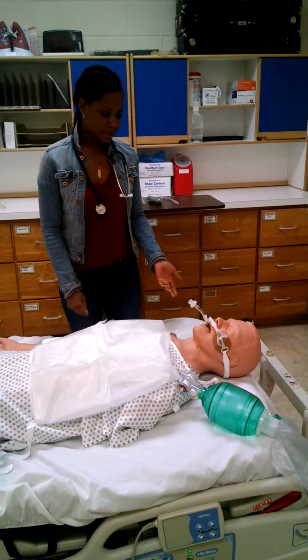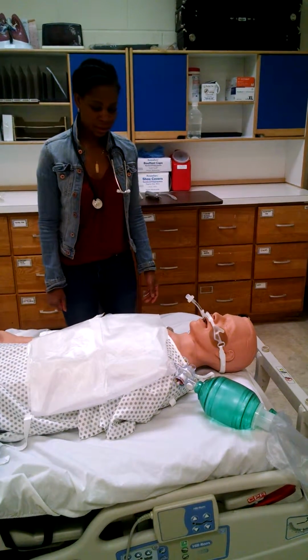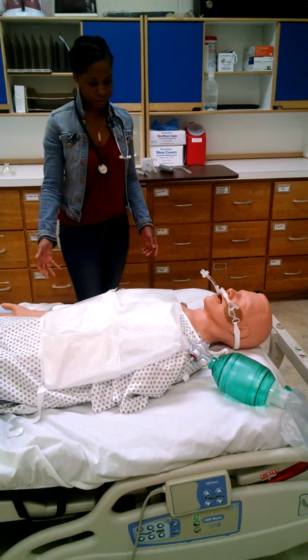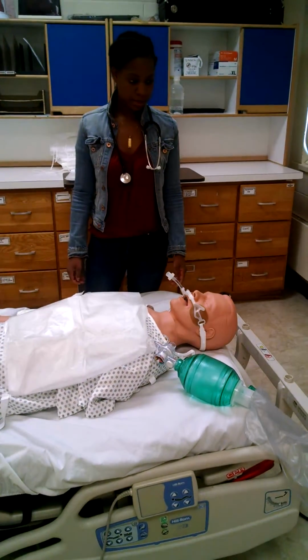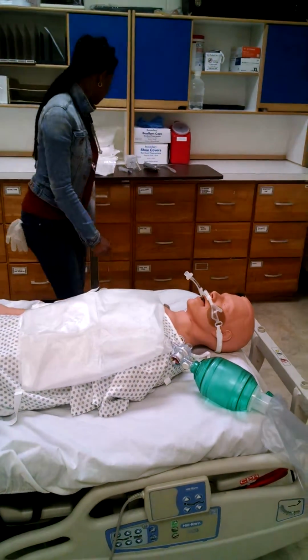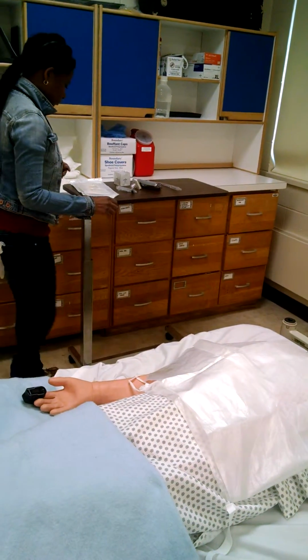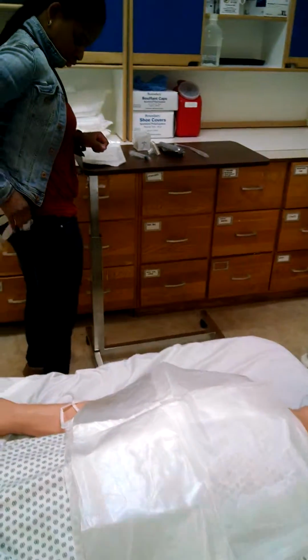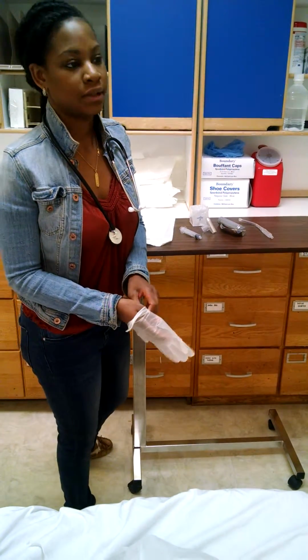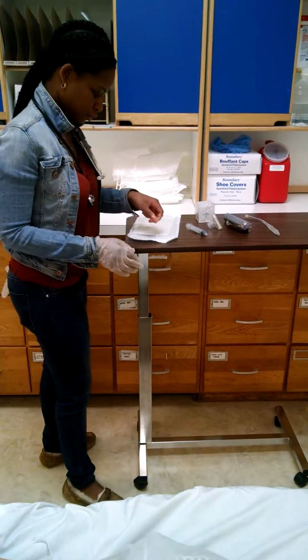The purpose of this procedure is to remove secretions from your lungs. Do you understand the purpose of this procedure? He would say yes or no. And now I'm going to go ahead and perform suctioning. Or excuse me, put on my sterile gloves. And my flow is already set to 15 liters. My oxygen flow.